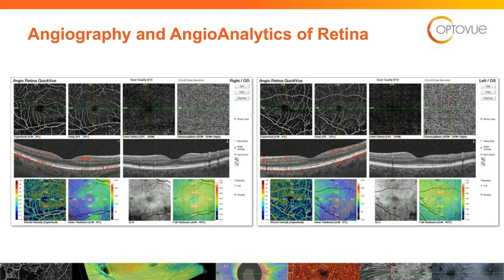And again, you're able to measure that, and that's going to be exciting whenever we're able to compare next year when she comes in as a progression to see how her vessel density is holding up. If we go over to the left eye, the same two, you can see that tie-dye map of that retinal thickness. You can see how it's more compromised than the right eye. And then you can see how that wedge defect just kind of comes right on over from where that came off of the radial peripapillary capillaries.